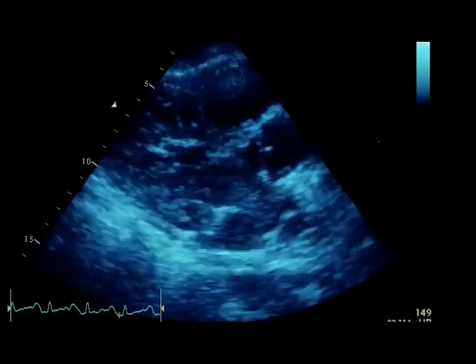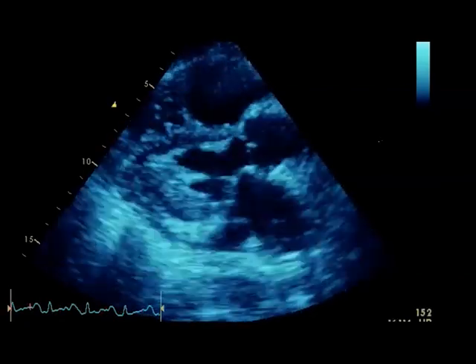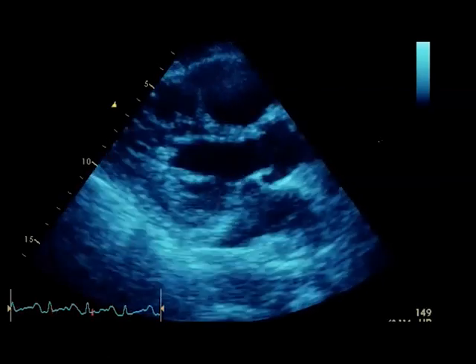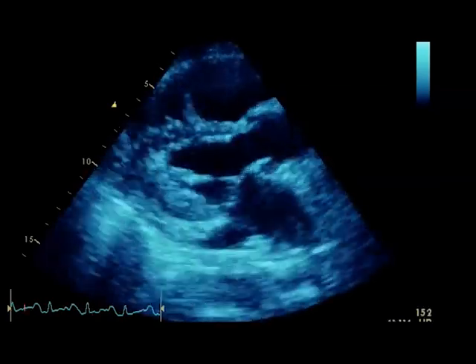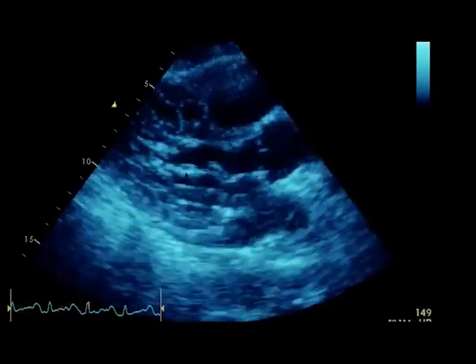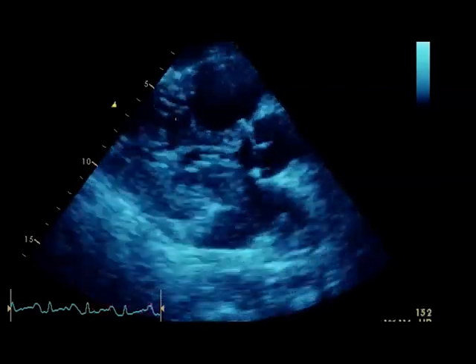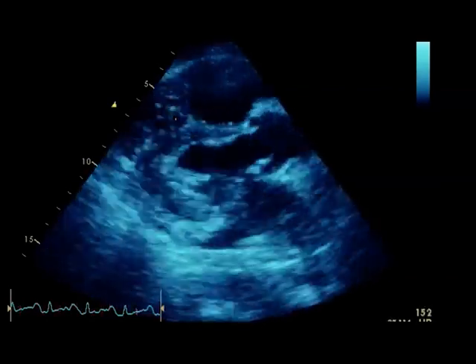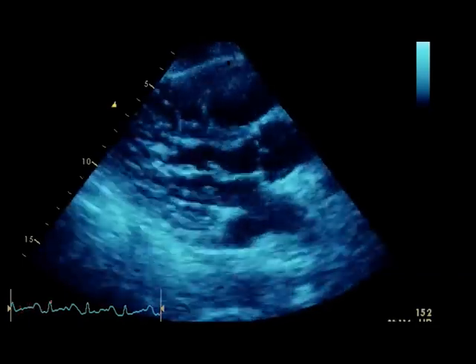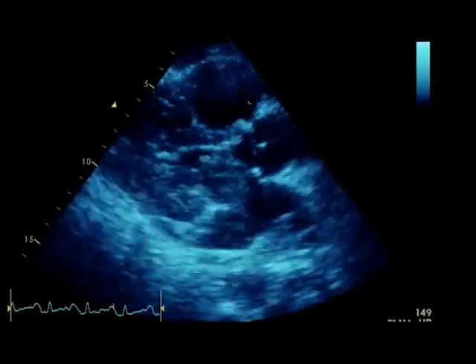I'll run through this scan quickly. As we did it on arrival, the first thing we saw in the parasternal long axis view is that the right ventricle looks bigger than the left. We are off-axis — you can see the apex of the left ventricle coming in — and the left ventricle looks like a little nubbin. We've got a heavily trabeculated right ventricle suggesting a chronic component to RV dilatation, indicating significant underlying pulmonary hypertension.